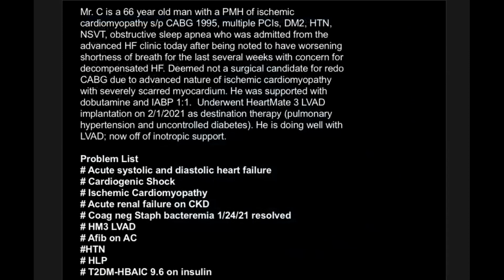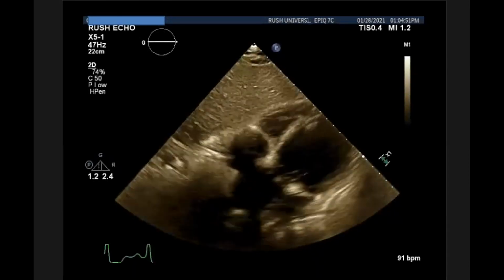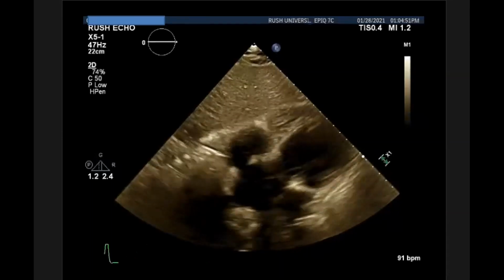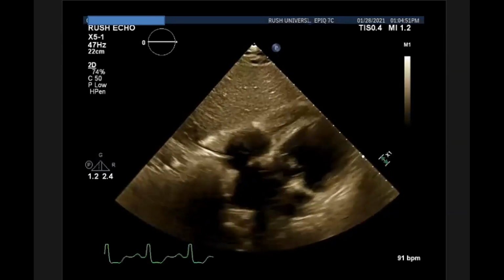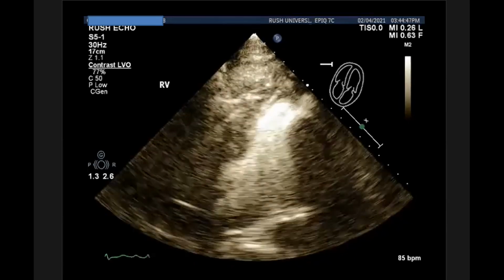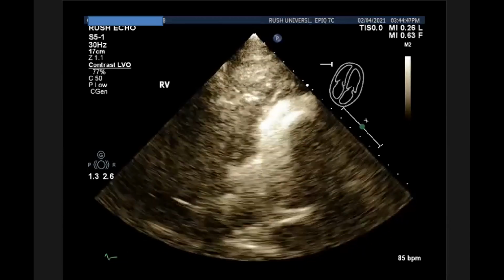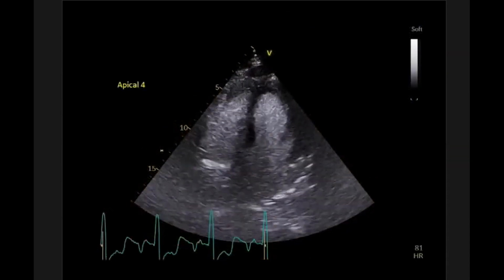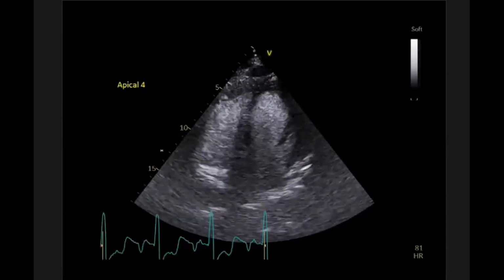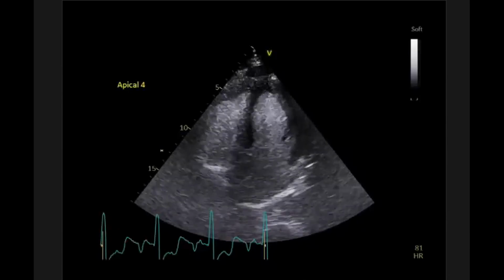This is another interesting patient with an ischemic cardiomyopathy, got his device implanted on February 1st. I tried to grab the images that could best depict the RV. You can see that the LV function is down, RV function is preserved. And here, shortly after the LVAD was placed, the RV dilated, there was RV dysfunction, and this patient did require an RVAD support. And here is his image after RVAD was removed. LVAD is still in place, but the RVAD was required for a few weeks, and this patient's RV function started to improve.